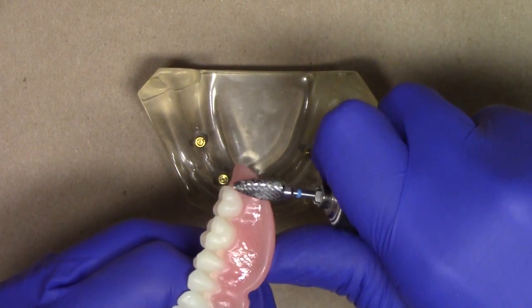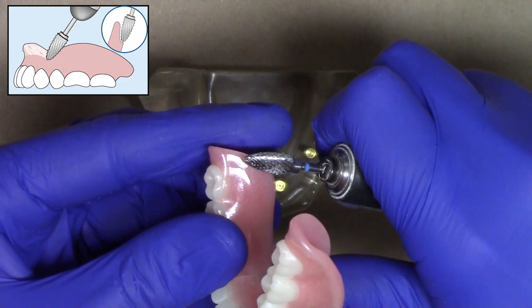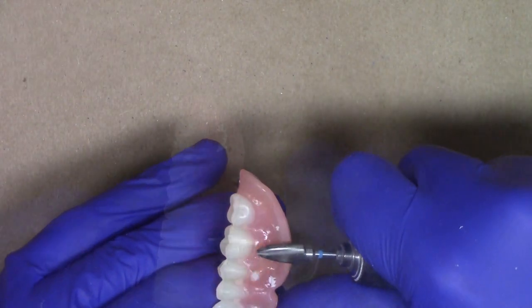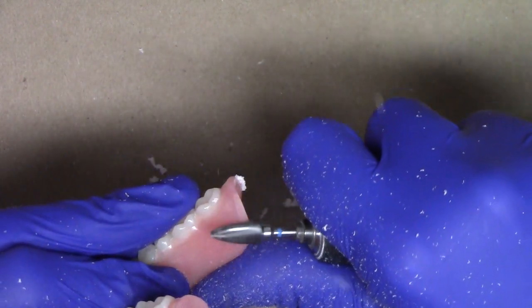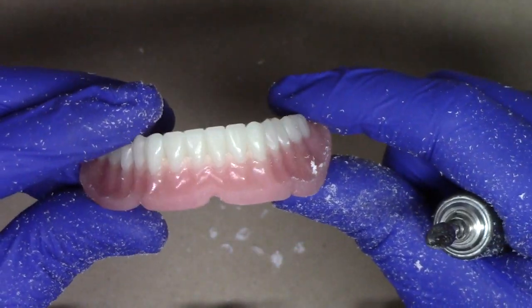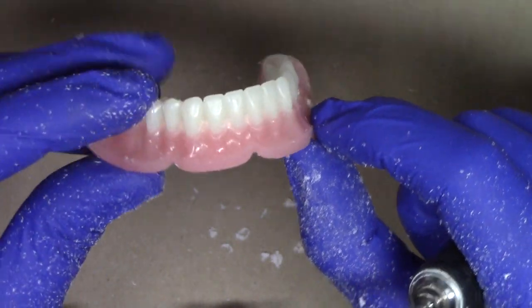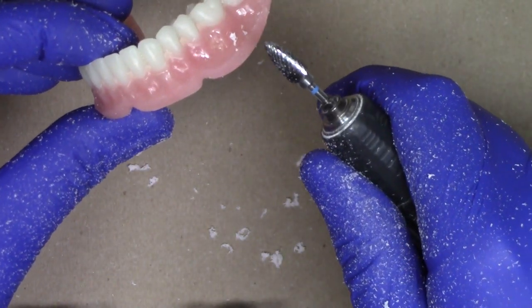Taking my trim burr, I'm just going to trace all along the edge of the facial aspect as well as the lingual aspect of this complete denture. And continuing on to the lingual. Now I've successfully beveled all of my edges. As you can see, there's this little area of that kind of matte finish to the denture versus the shiny finish right in here. Very simple to do using my trim burr.